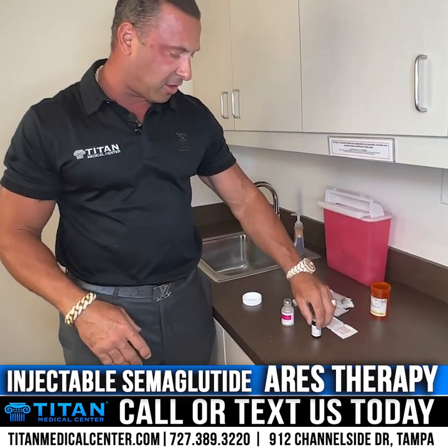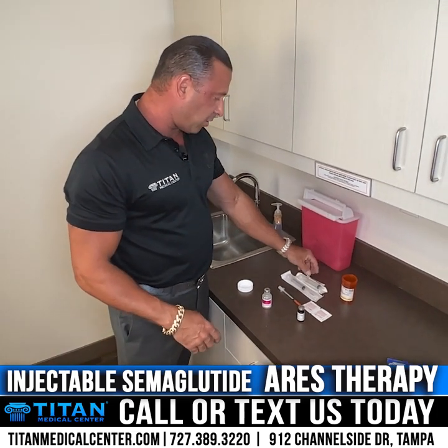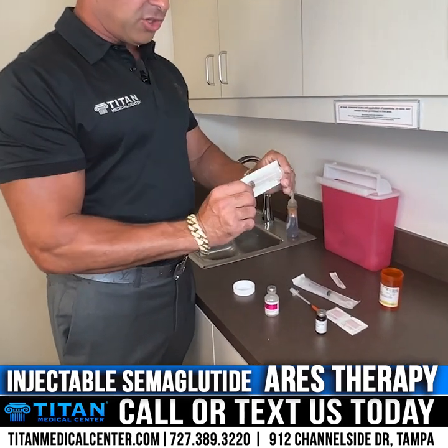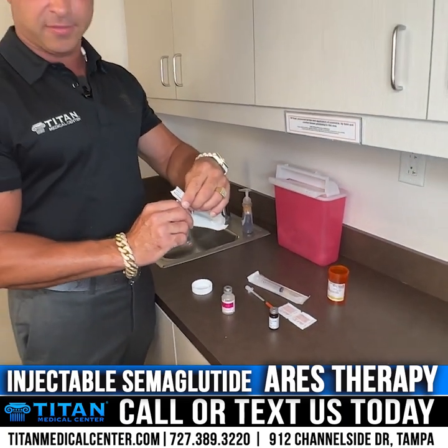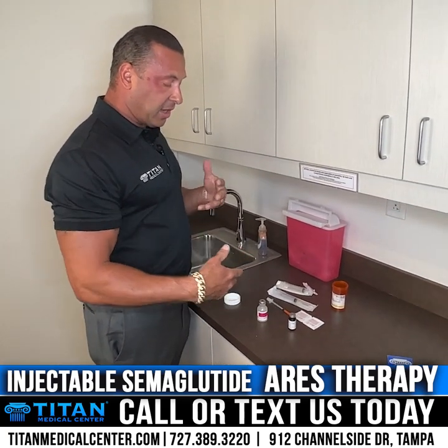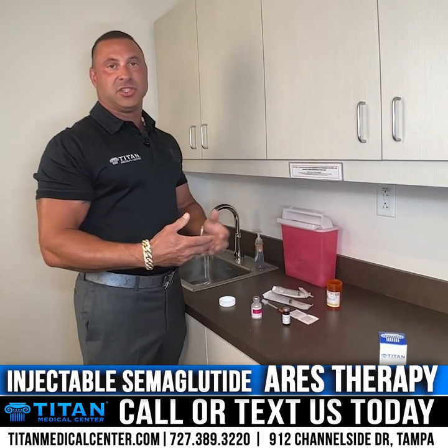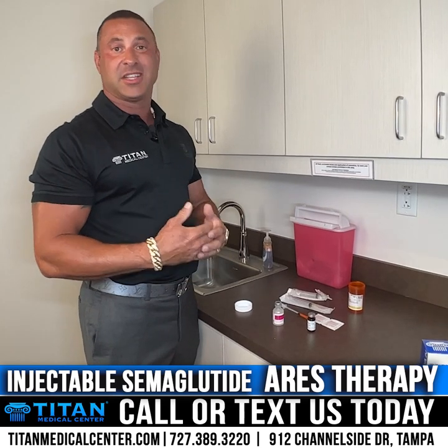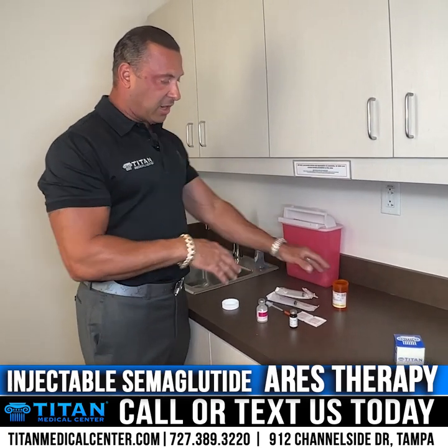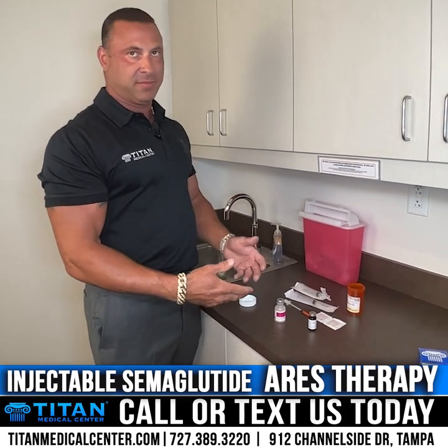You'll also have bacteriostatic water — this is your reconstitution diluent. You might also have a syringe and needle already assembled, or they may come separate and you'll just put them together. After that, you'll do the reconstitution of your medication. Reconstitution is when you add the diluent to the medication to make it active. The medication comes lyophilized, which preserves the concentration until it's ready for active use — that's why you reconstitute it. Pay attention to the directions on your amber vial for how much diluent to use.